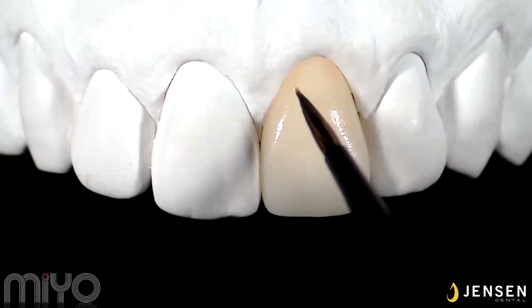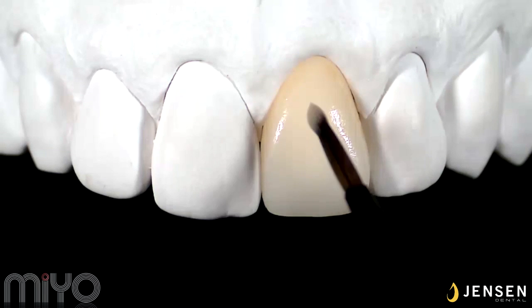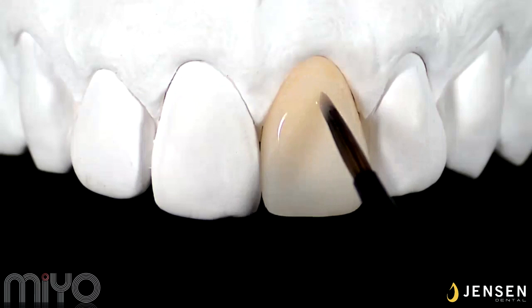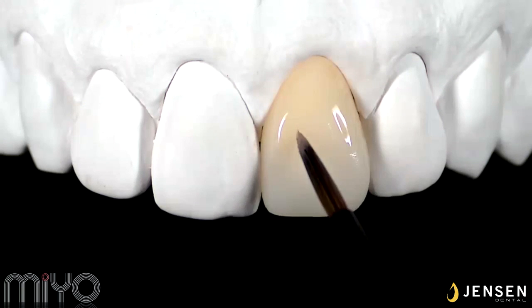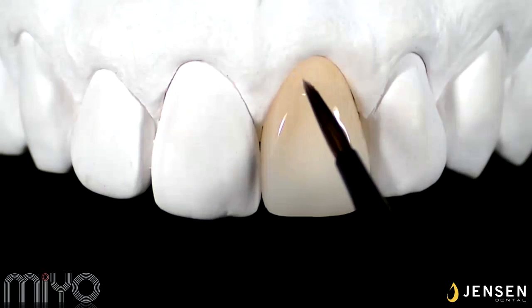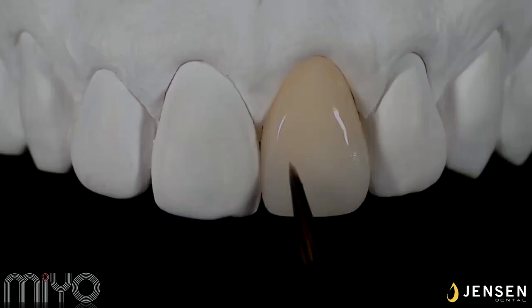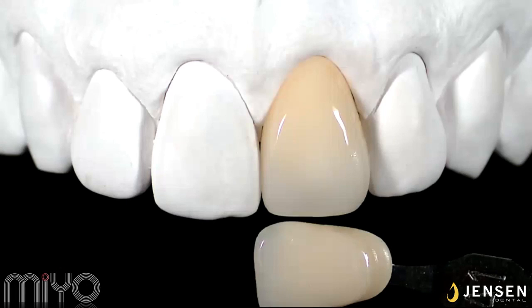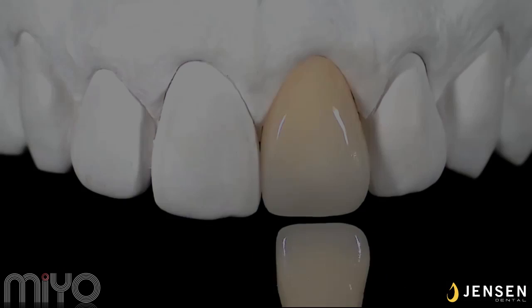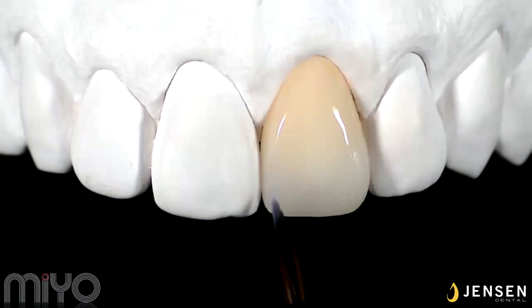Translucent straw is applied. The application method is very close to paste opaque. Create that thickness with the material to have evenly colored zone. Always check your shade tab in all directions to eliminate possible optical illusions leading to a wrong target shade. Translucent storm is applied on the incisal 1/3 to create that low value canvas.